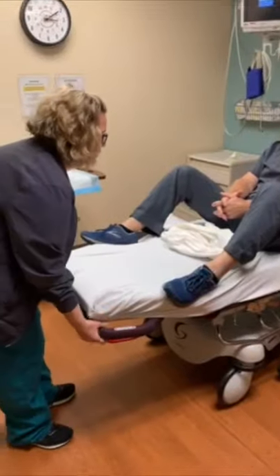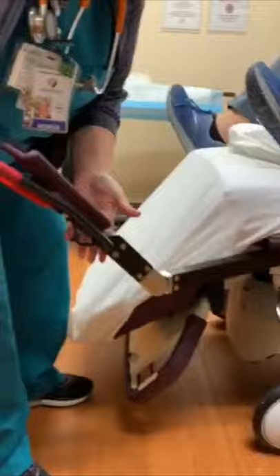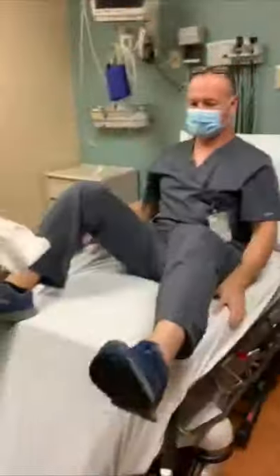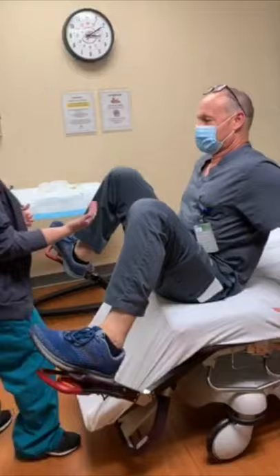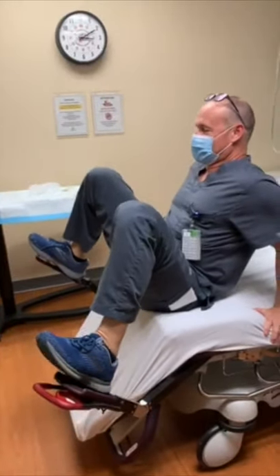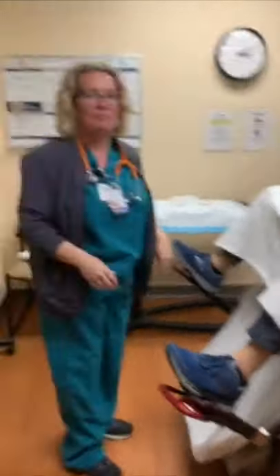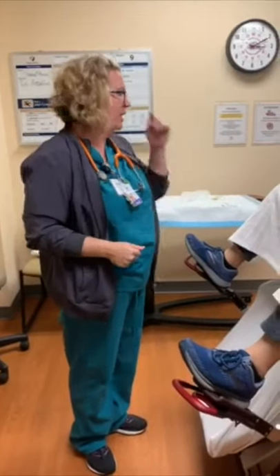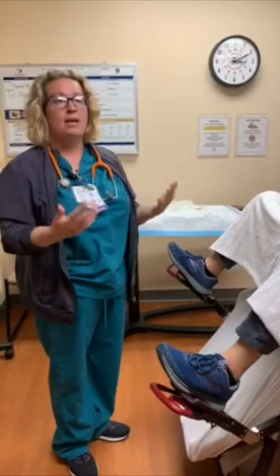So you just have them get ready. There are two things you pull down, then out here you pull this leg support up and pull this leg support out. Go ahead and have them scoot all the way down — you want their butt to be almost to the end. Then they can lean back and relax. The doctor may want a stool to sit on or the bed raised. There is also a lamp that they may request, which should be in room nine as well.